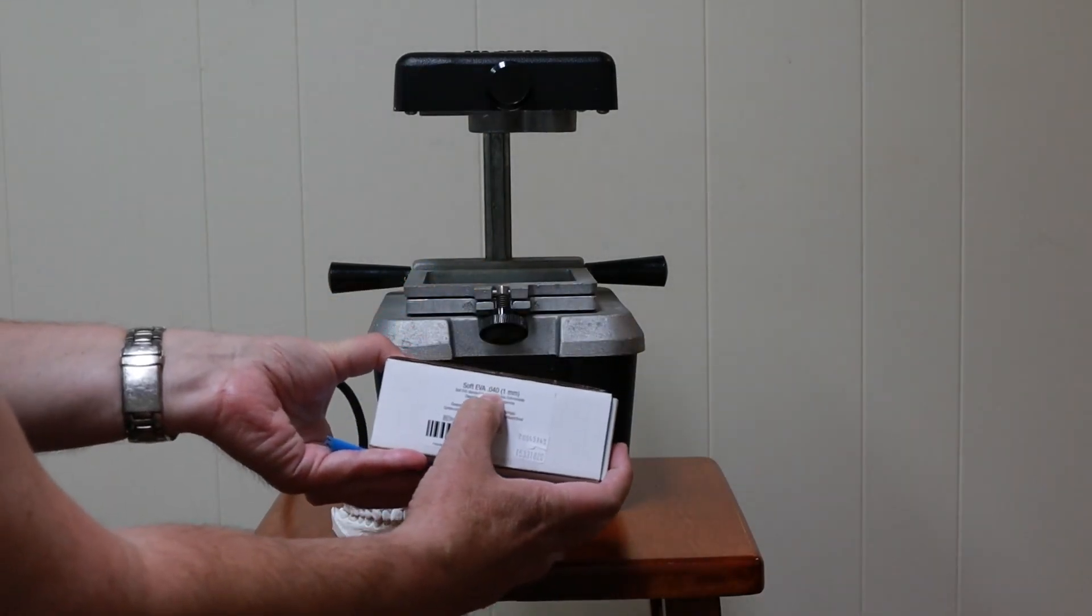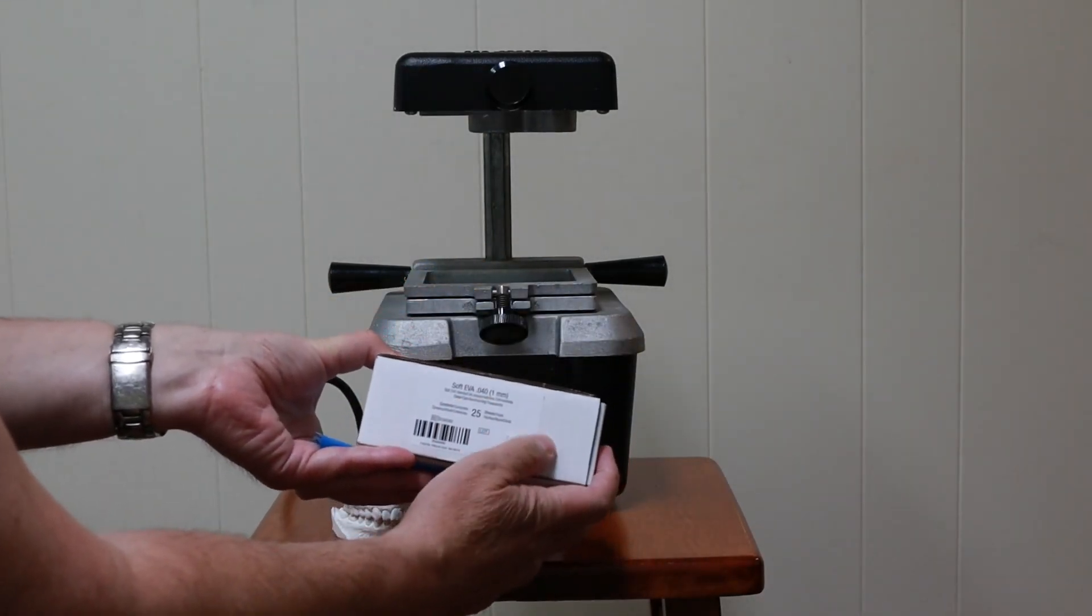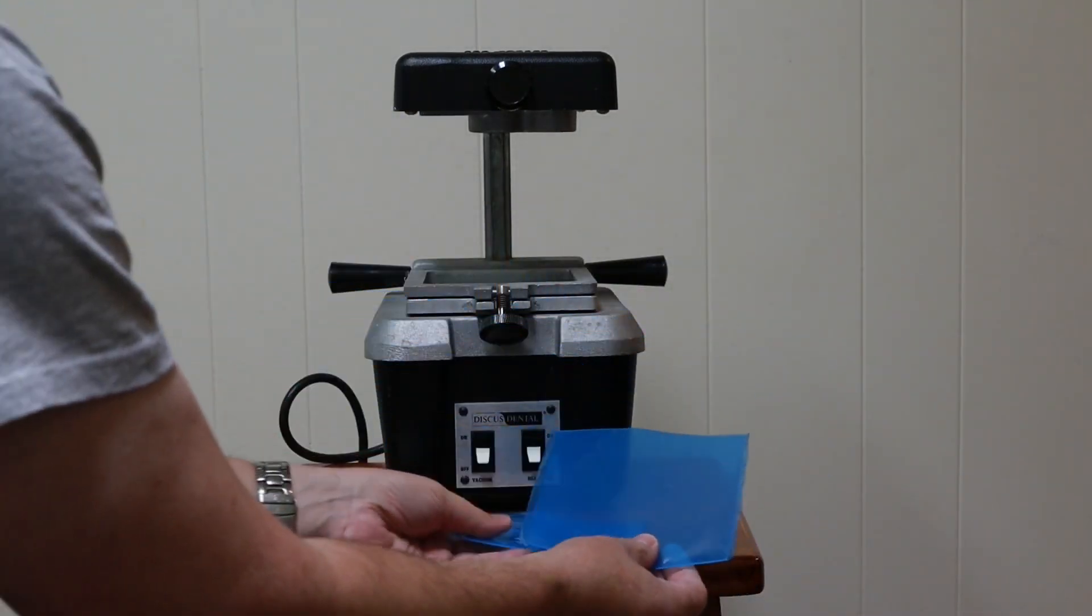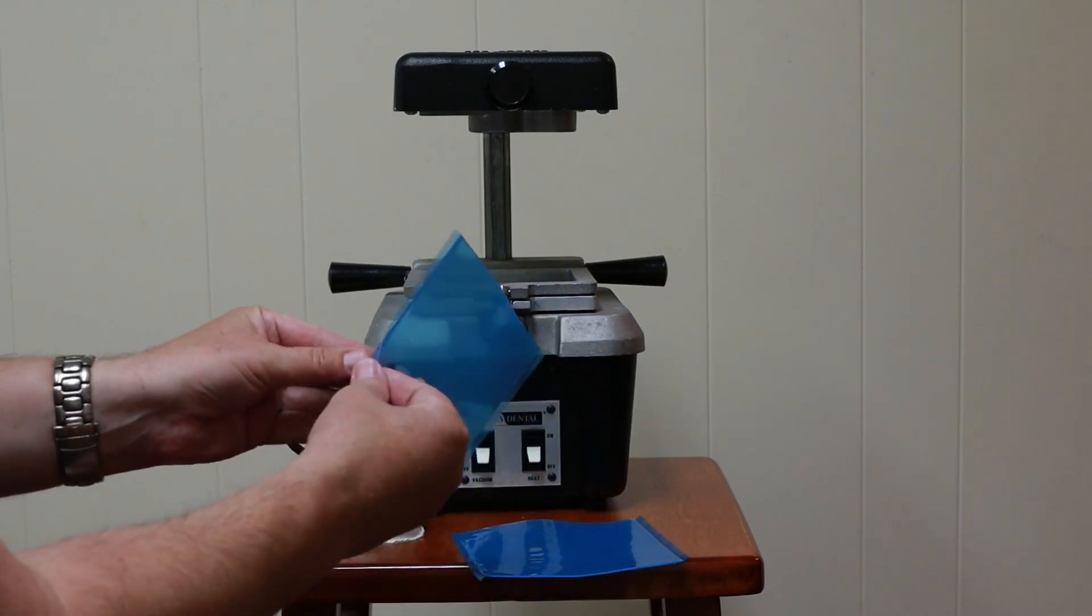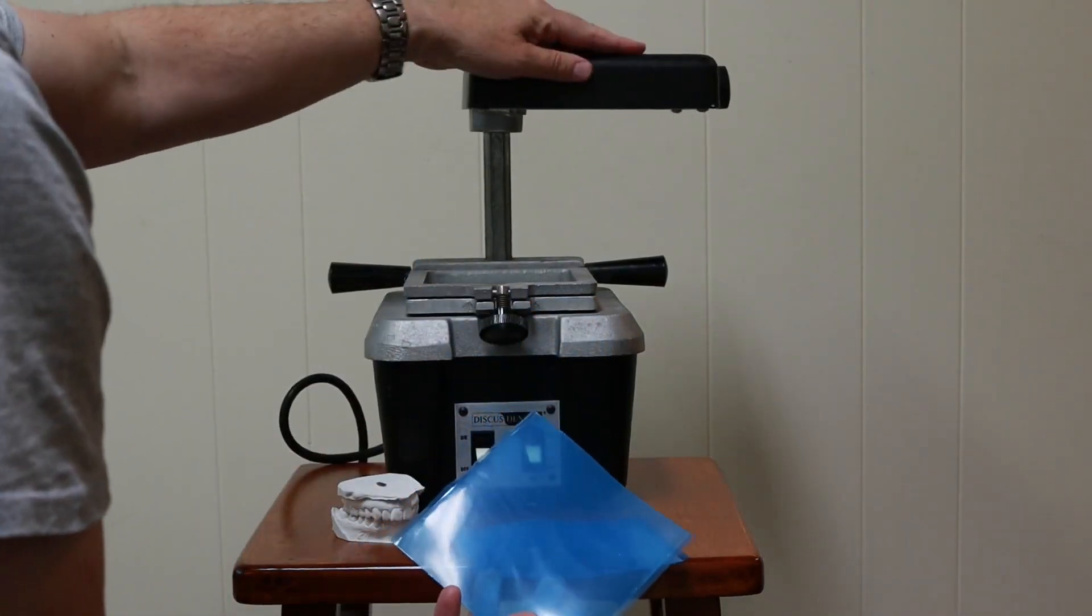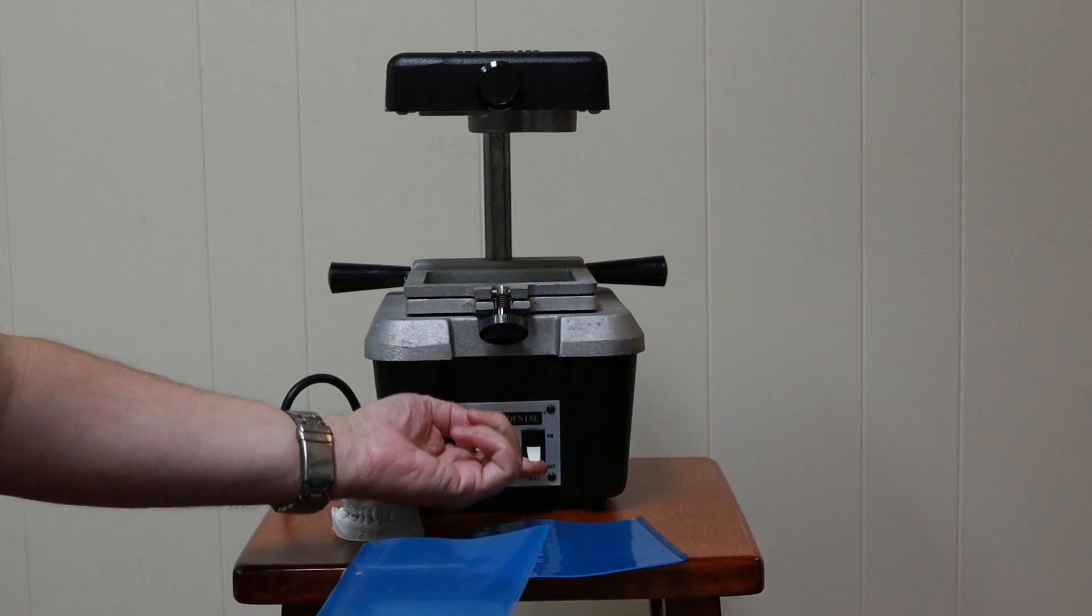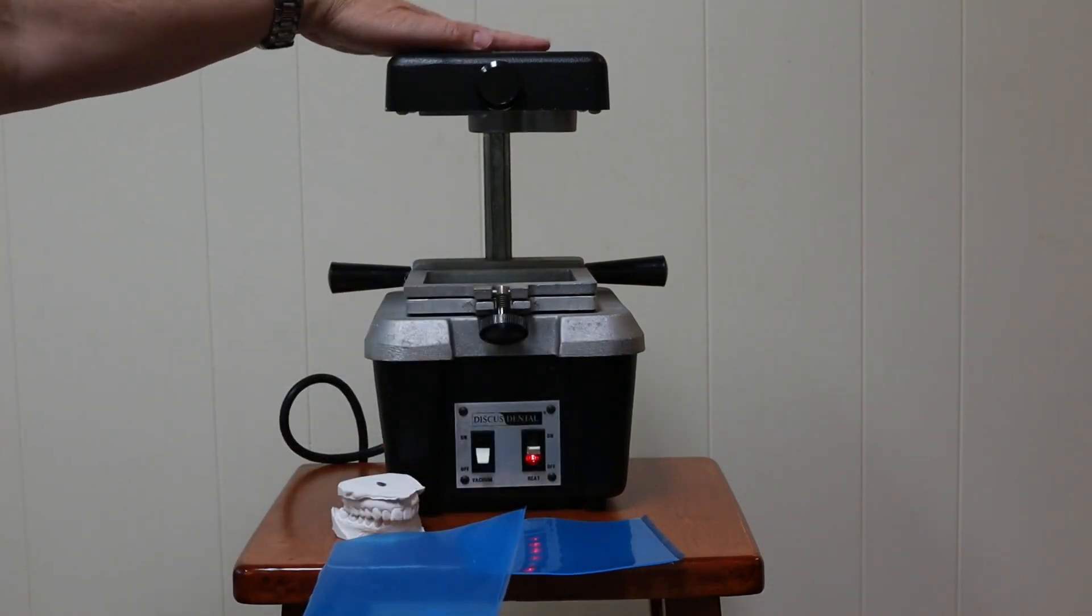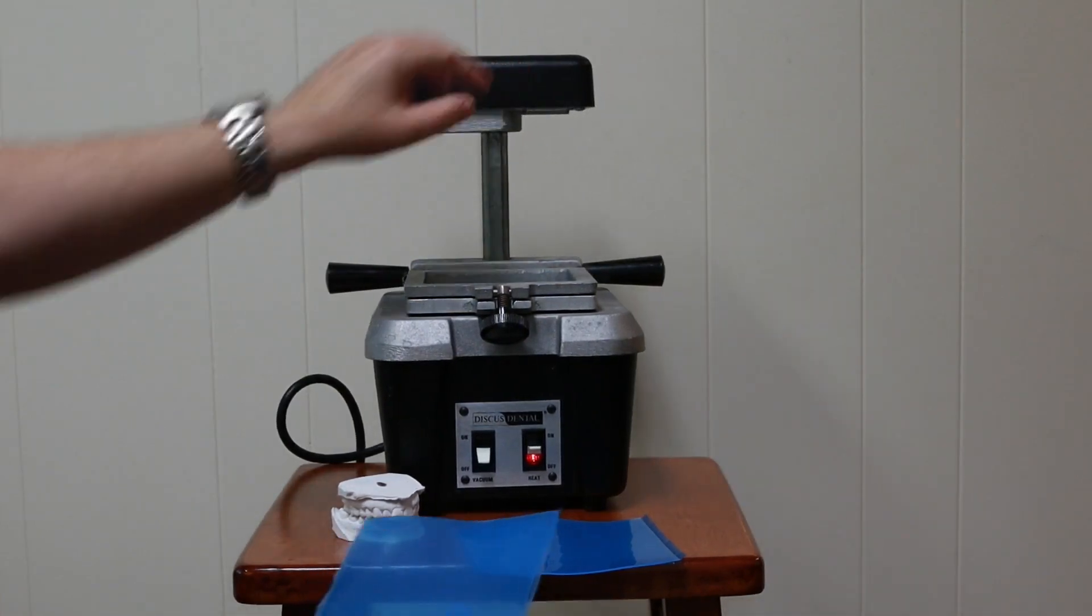This is 40 thousandths thick, so it's about a millimeter thick. First step, I like to turn on the heater on the vacuum forming machine. The heater is up here so this will get warm. Let me rotate that out of the way.